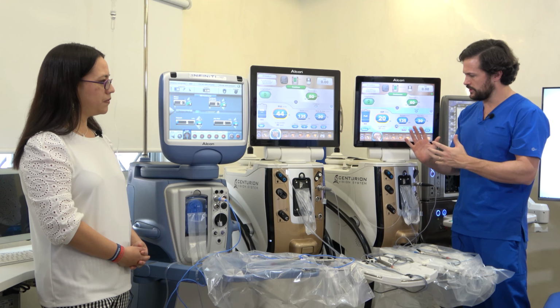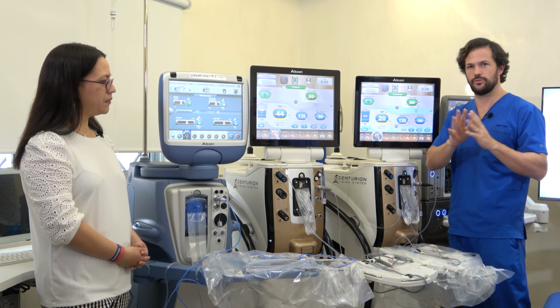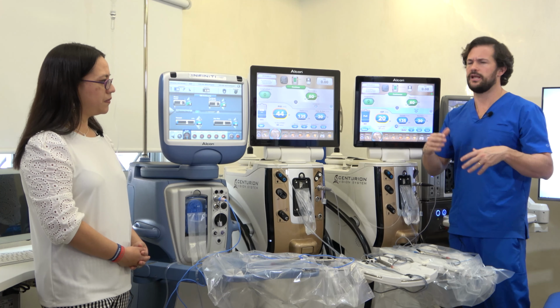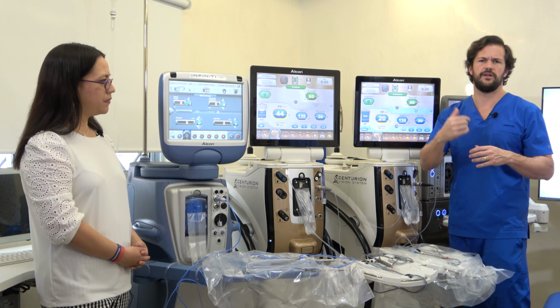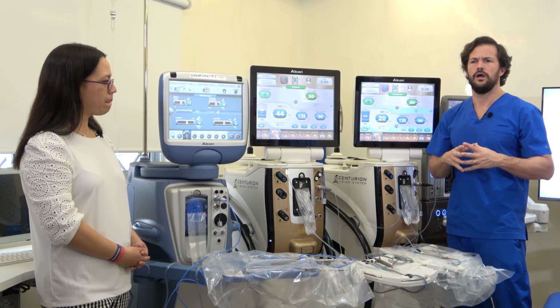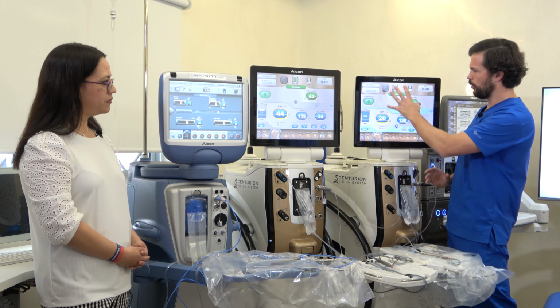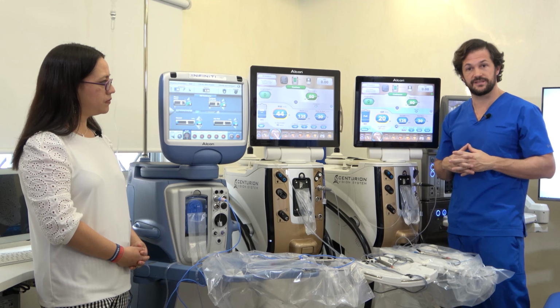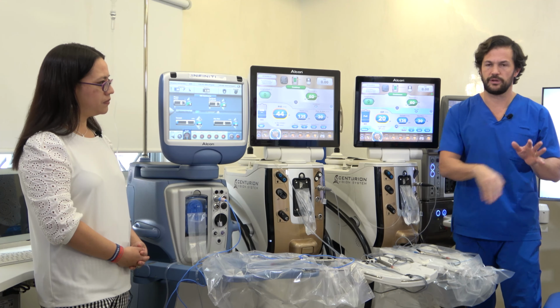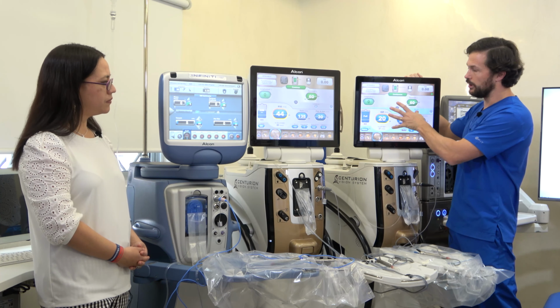It's very important for you to understand that to start, you need parameters with safety, and also you need to be able to sculpt. It doesn't matter if you go to chop, even early, you always need to know how to sculpt, because that could be very helpful in many situations. Okay, so to sculpt, we like to say that ultrasound is king. Very important that ultrasound is the one who's going to sculpt that trench so you can then crack it. Okay, so the important thing is going to be ultrasound.